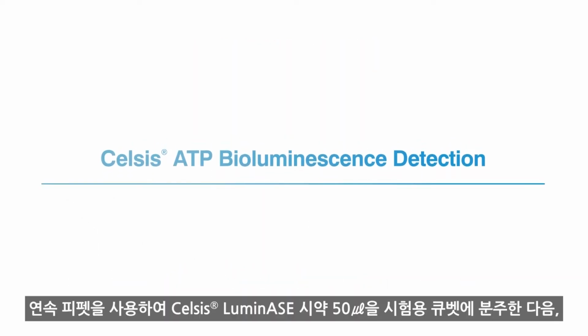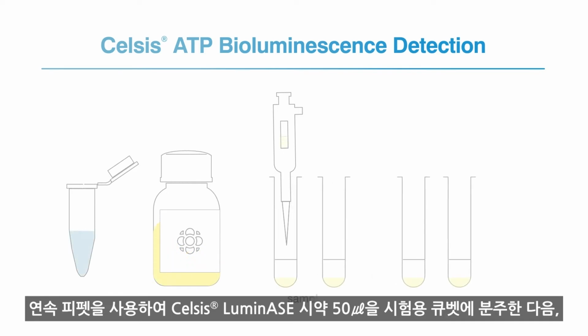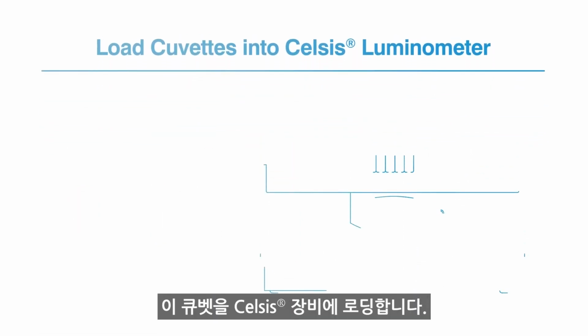Using a repeating pipette, add 50 microliters of Celsis luminase reagent to Celsis assay cuvettes. Then transfer 50 microliters of concentrated sample in duplicate to the cuvettes containing the reagent. These cuvettes are then loaded into a Celsis instrument.